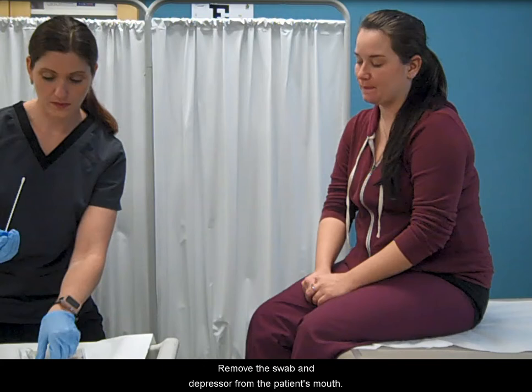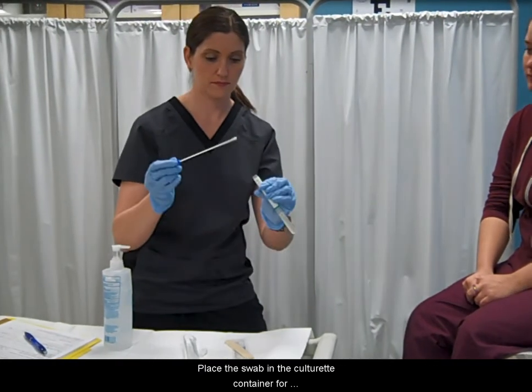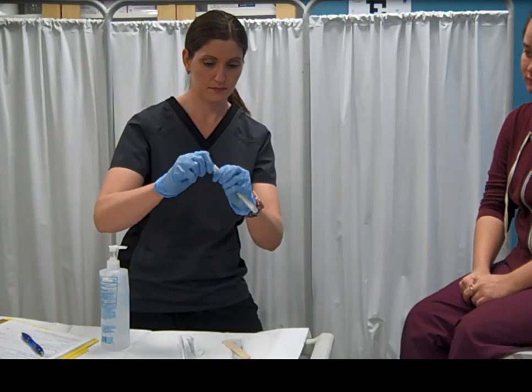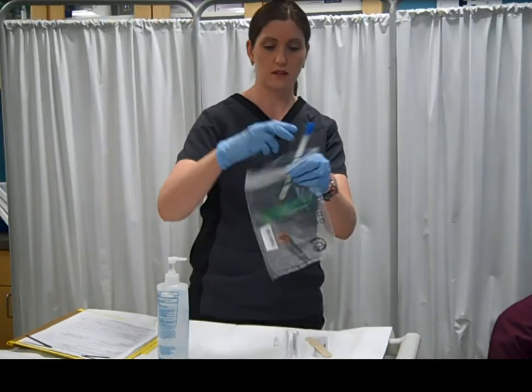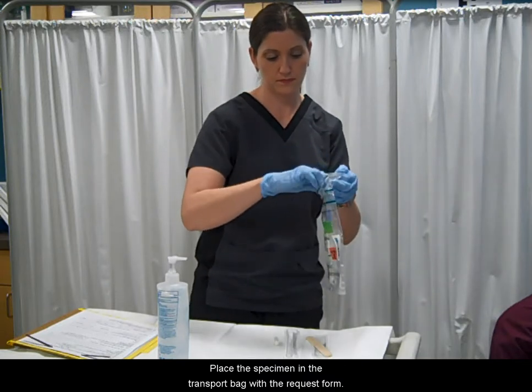Remove the swab and depressor from the patient's mouth. Check on your patient and make sure they are okay. Place the swab in the culturet container for transportation to the lab. Place the specimen in the transport bag with the request form.